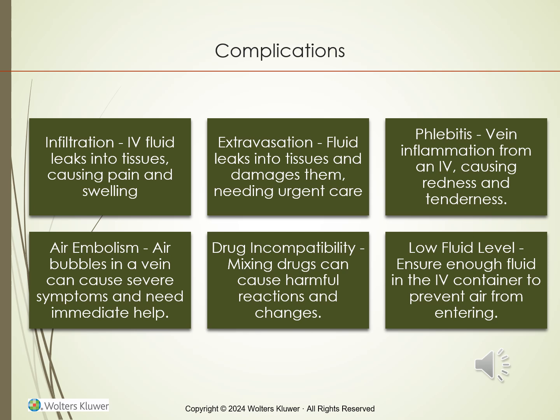Low fluid levels. So if the IV container's fluid falls below the level of the spike, if you're using a bag or a large bottle, you want to ensure that there is enough fluid in the drip chamber to prevent air from entering the tubing. No air should be introduced from an empty container or blood backing up from the insertion site.